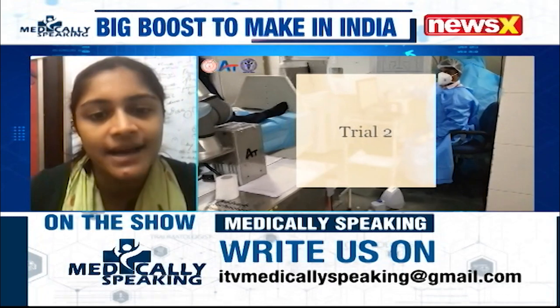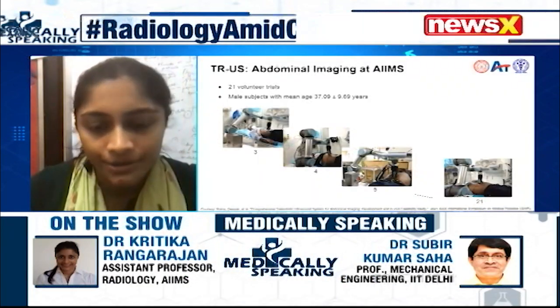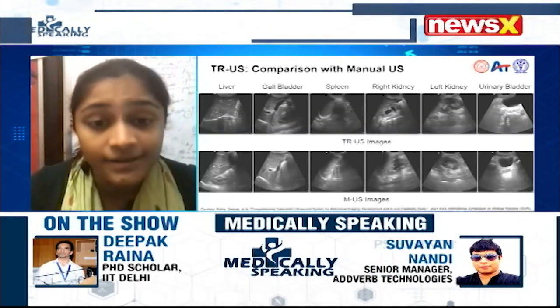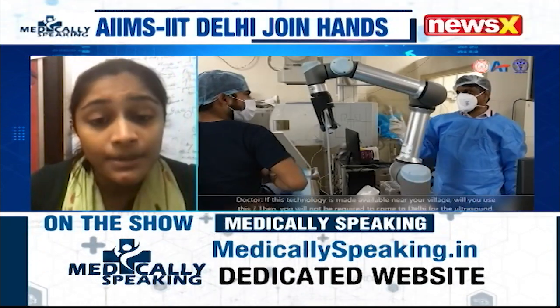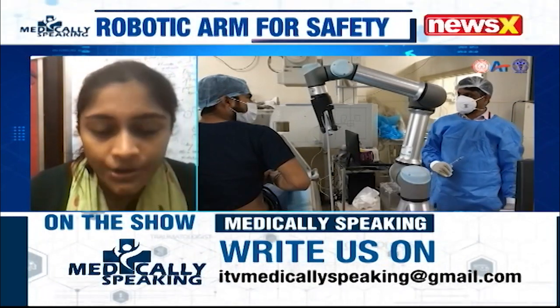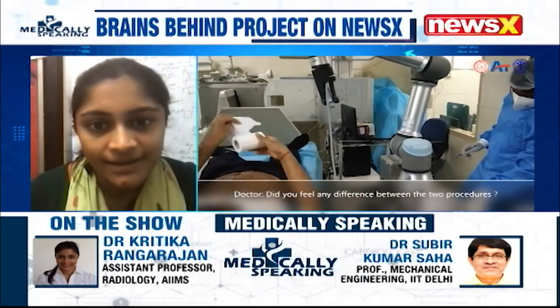So what we realized is that every time there was a call from a COVID ward, a radiologist would have to change into a PPE kit, go inside, perform the ultrasound and come back. What this entailed is a long wait for the patient, because you have to wait for the radiologist to finish off their CTs and then come. We were also consuming one PPE kit every time the radiologist goes in and comes out, which is a huge resource that we end up wasting. There's a huge environmental burden when it comes to PPE kits. So that was really the genesis of the idea.